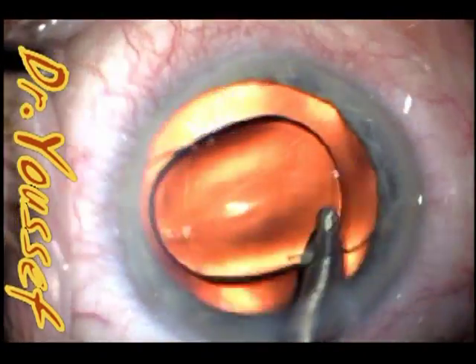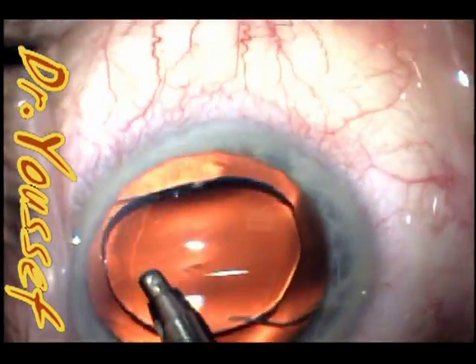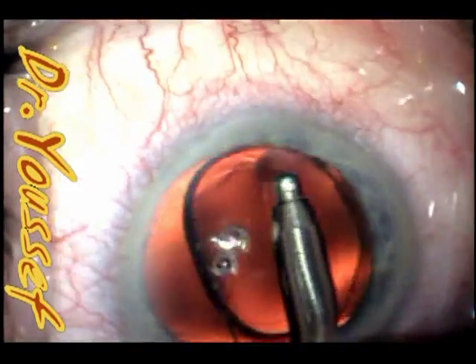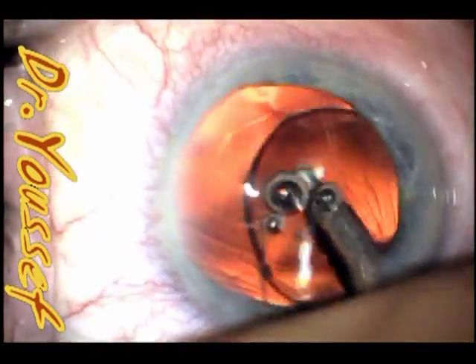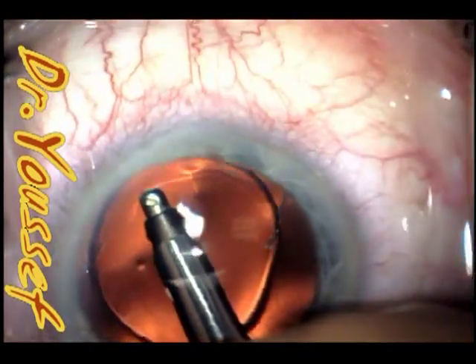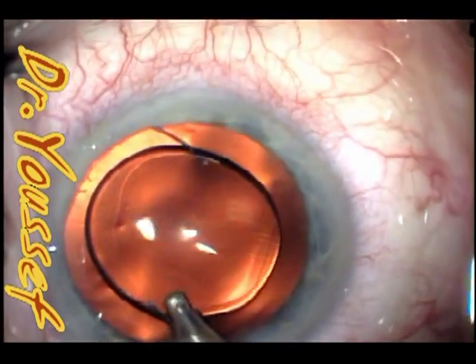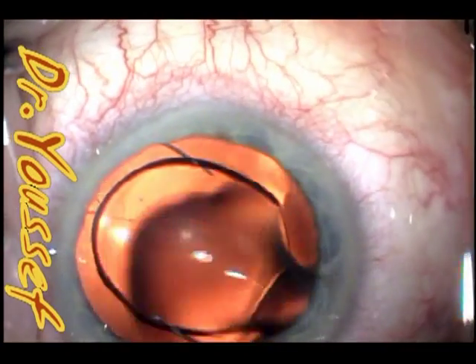I tend now to leave all intraocular lenses in the vertical meridian most of the time, except for toric lenses — those depend on the axis of the astigmatism. For regular cases, I implant the lens and leave it vertical. As of the 2009 literature, they said it's better and more stable that way.